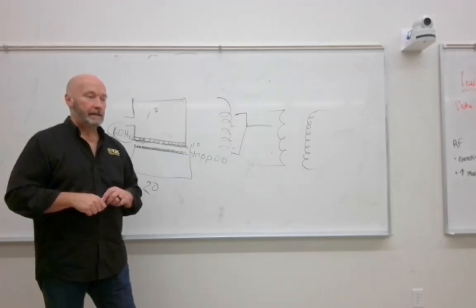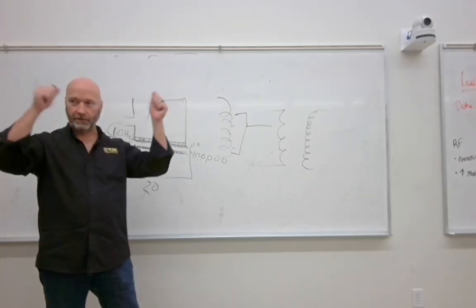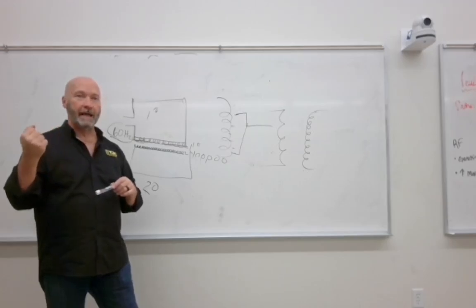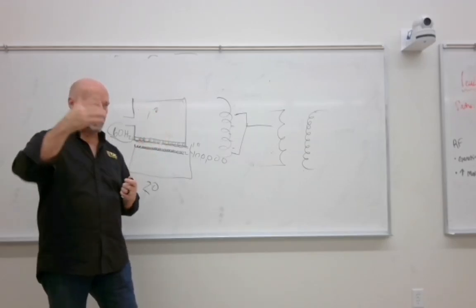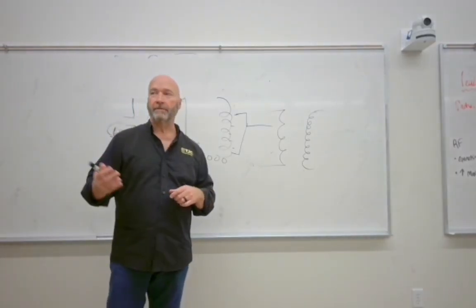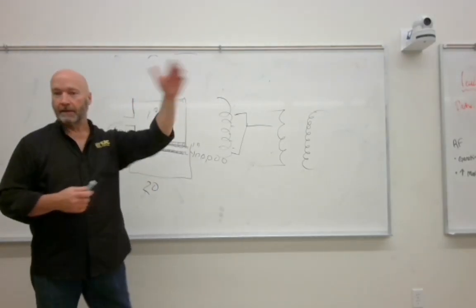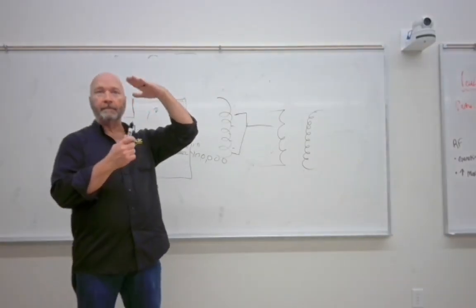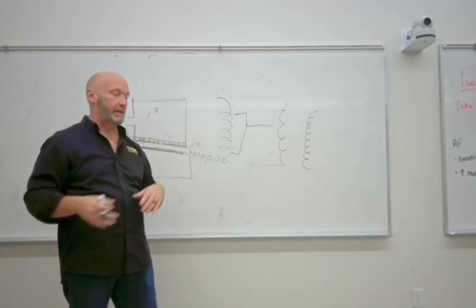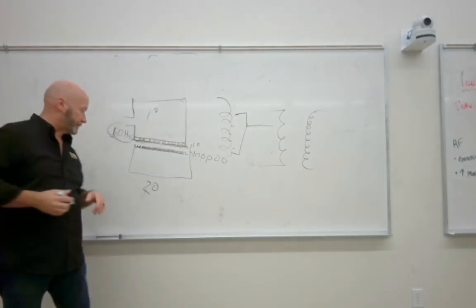Whenever you move the control tower, the X-ray tube and the tower itself, whenever you squeeze the handles or push the buttons to enable you to move it up and down, or the length of the table, you're actually activating solenoids. So the default position for those, let's say we've got a rail here. Next time you're in clinicals or in a lab, just look up at the ceiling. And what you'll see is 4 rails.